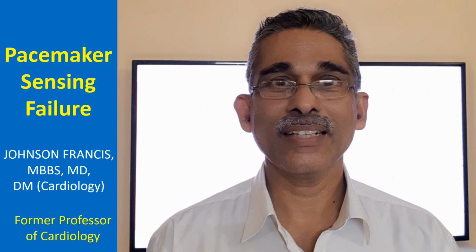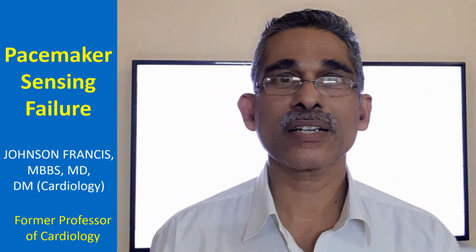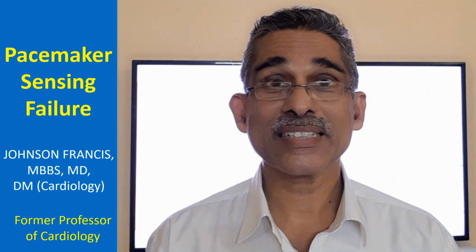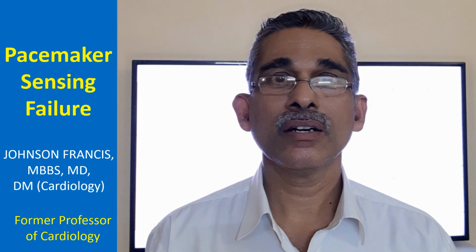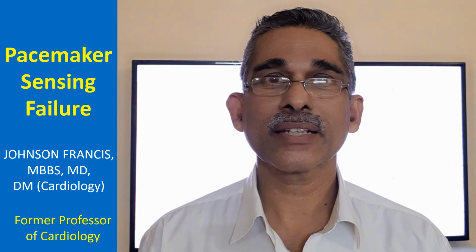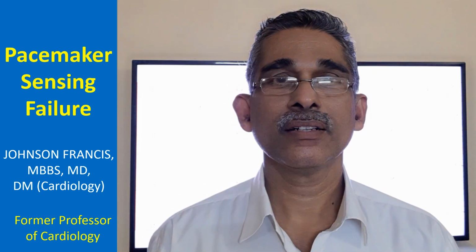While assessing the ECG of a person with a pacemaker, two important aspects to be thought of are the pacing function of the pacemaker and the sensing function. Pacing function is simple to understand. The function of the pacemaker is to give regular electrical signals to pace the heart.